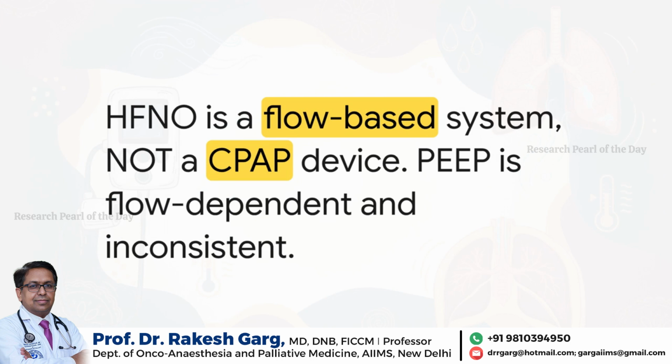Now, let's pause here because we need to clear up a common misconception. HFNO is a flow-based system. It is absolutely not a CPAP device. Yes, okay, it does generate a very mild positive end expiratory pressure, or PEEP, roughly 1 centimeter of water for every 10 liters of flow, which is highest when the patient keeps their mouth closed. But, and this is a big but, that pressure is entirely flow-dependent and incredibly inconsistent.